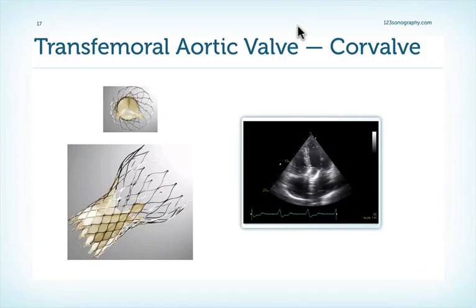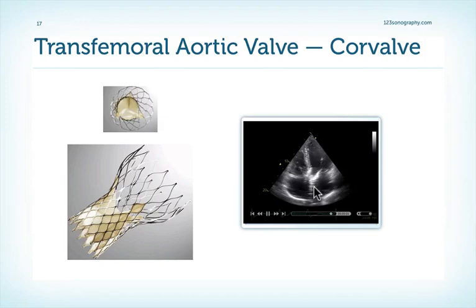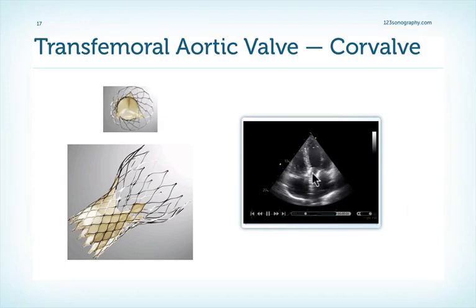This is another biological aortic valve which you will see more and more frequently — the so-called CoreValve. It is a valve-and-stent type of valve, where we have metallic structures, the stent, and within this stent we see the tissue of the valve. The typical feature of this valve is that it has a fairly long stent which protrudes fairly far into the LVOT, all the way to the base of the mitral valve leaflet. This is not an abnormally positioned valve, but the typical feature as you would see it in a five-chamber view. Note that you can appreciate the biological tissue right here, and the typical wireframe structure of the stent here in the LVOT.